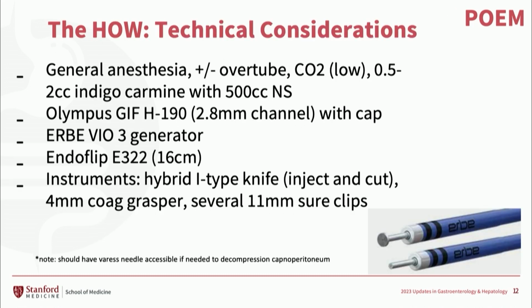So now we'll talk a little bit about the how and go over some technical considerations, starting with POEM. There's various approaches to achieve the same result. So I'm just going to share how we approach these patients here at Stanford in our technical approach. But again, these patients are all intubated under general anesthesia. We don't currently routinely use the overtube for POEMs.